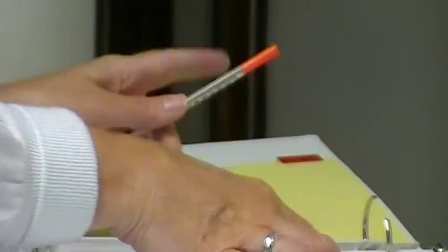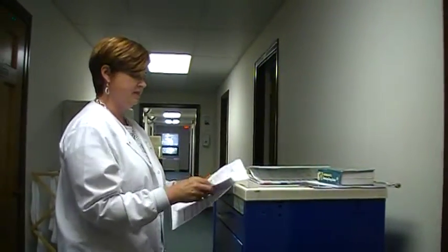Ready to give the medication — I'm going to grab the MAR, the syringe, and alcohol preps. Prior to leaving my workstation, I'm going to make sure the book is closed for HIPAA purposes, and also make sure the cart is locked so that other patients cannot get into it.